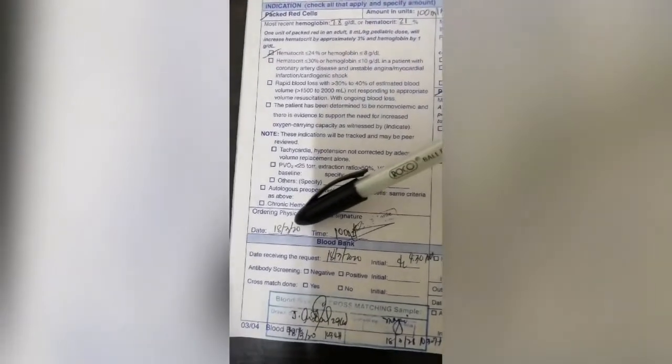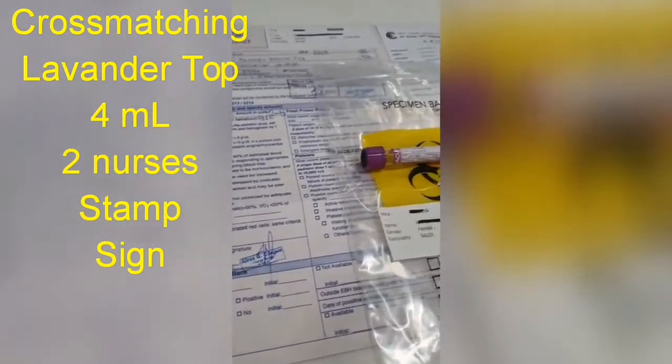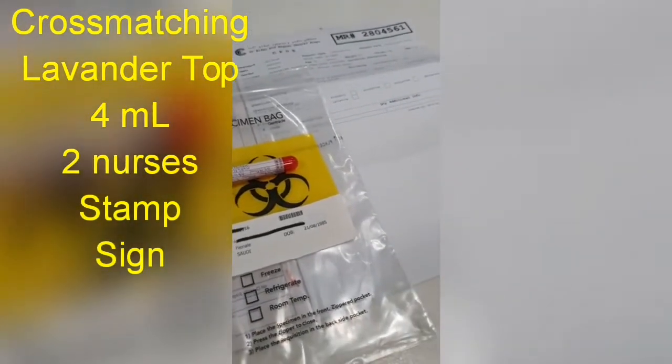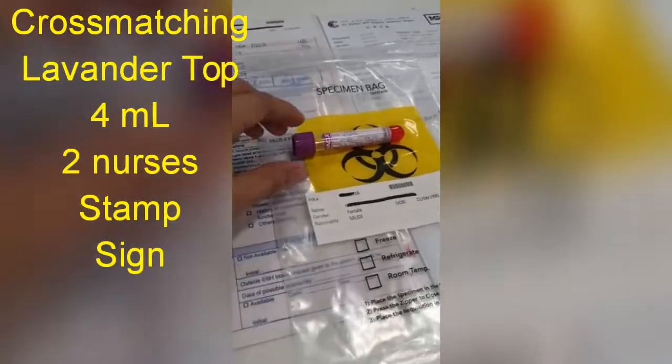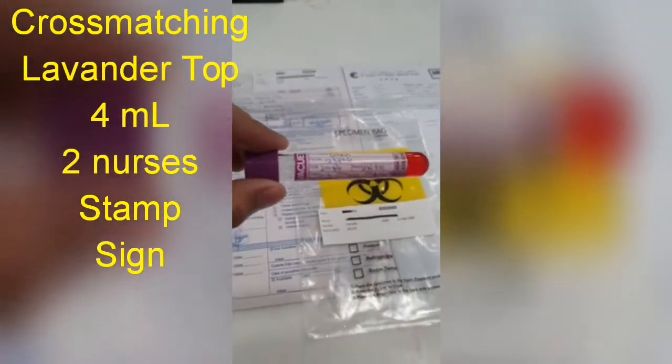And make sure that the doctor ordered, signed, and stamped together with the date and time. Make sure that 2 registered nurses will sign and stamp the blood type cross-matching sample with the date and time. For a patient for elective blood or blood components transfusion, a properly labeled blood specimen shall be collected. It is a lavender top with at least 4 ml blood to be extracted.